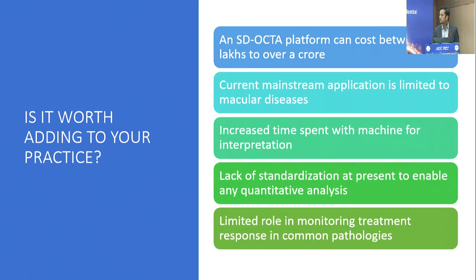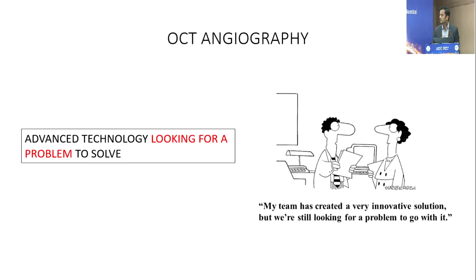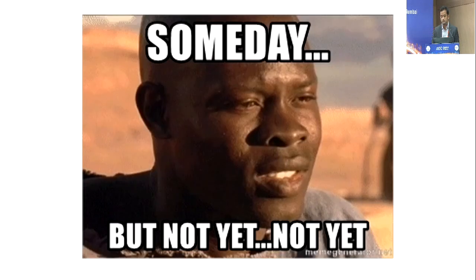So to conclude, is OCTA worth adding to your practice, considering its high cost, limited clinical utility, lack of standardization and inter-user agreement? At present, I would say it appears to be more of a solution looking for a problem rather than being an actual solution to a problem. So maybe someday it will be required in clinical practice, but not today.